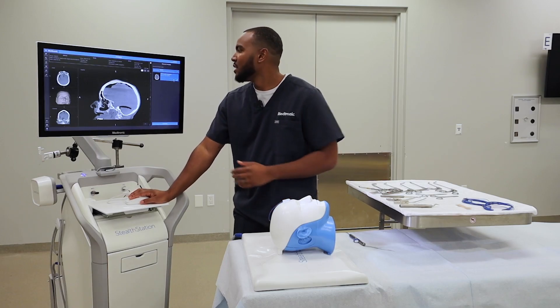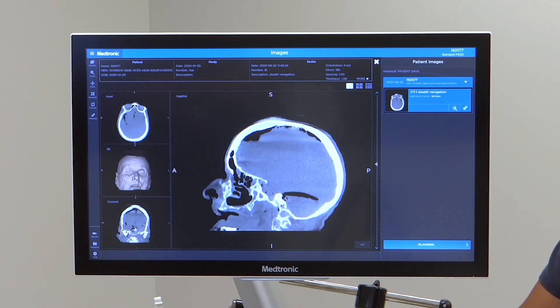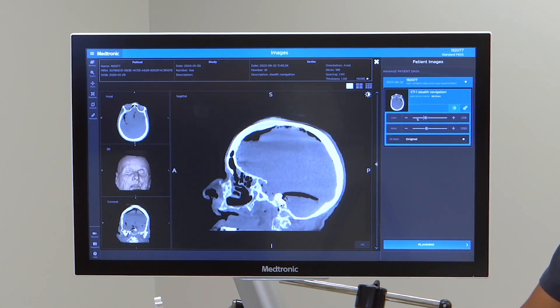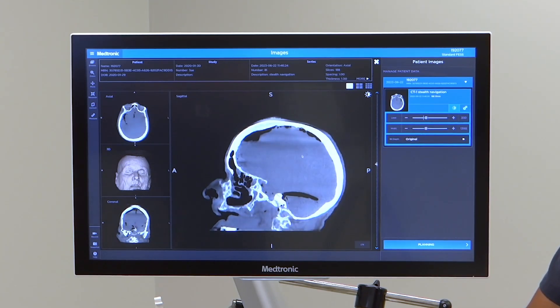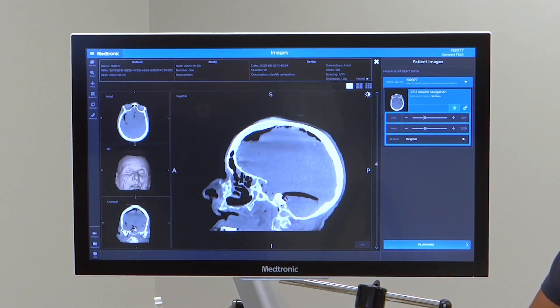To adjust the contrast, click the sundial symbol and you can adjust the level or width using the bar, or you can click directly on the scan itself — side to side to adjust the width, and up and down to adjust the level. What I like to do is a staircase method: go side to side, up and down, until you're happy with the contrast.